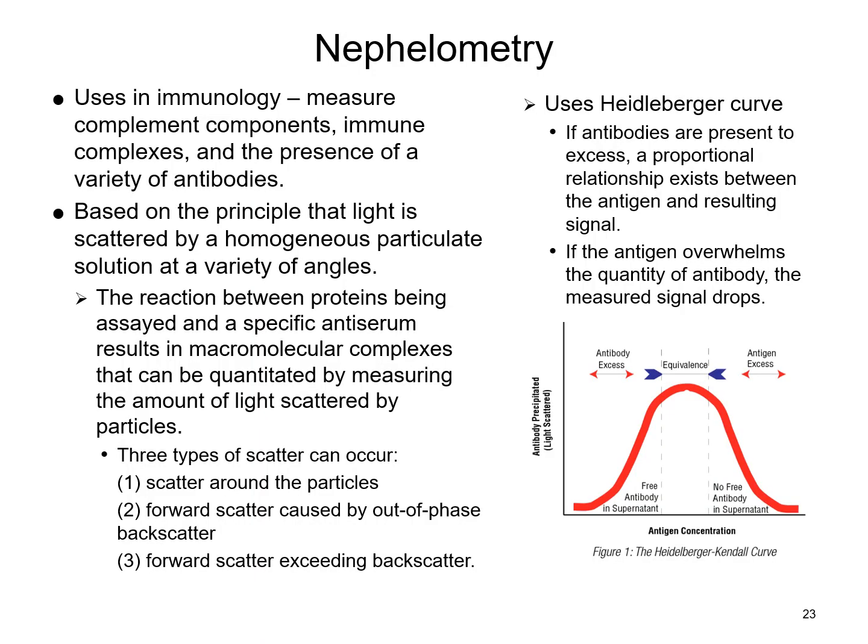Wow, we've come a long way with those precipitation agglutination reactions to get back to precipitation reactions. So your precipitation reaction, as we previously mentioned lectures ago, is done by doing nephelometry. The quantity of cloudiness or turbidity in a solution can be measured using a photometric type of method. When you have specific antigen-coated latex particles acting as a reaction intensifier, and they agglutinate with the corresponding antibody, you will have an increase in light scatter of that solution.